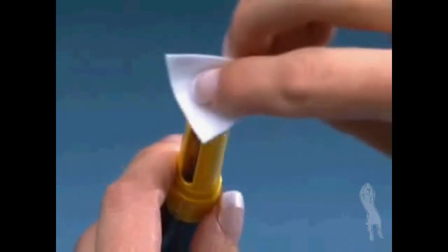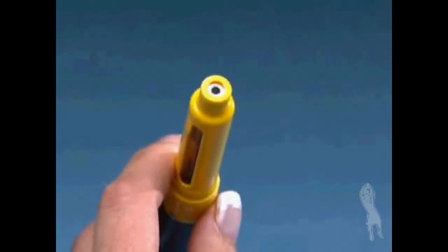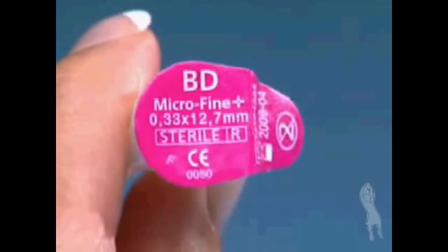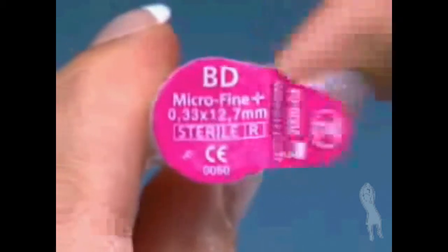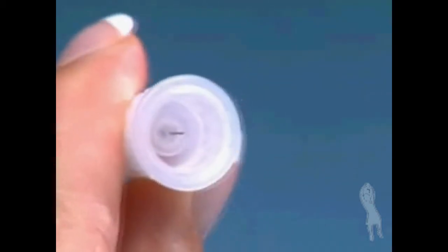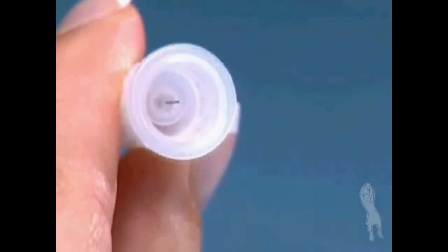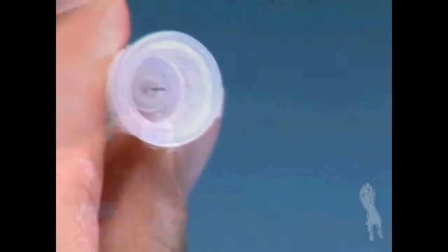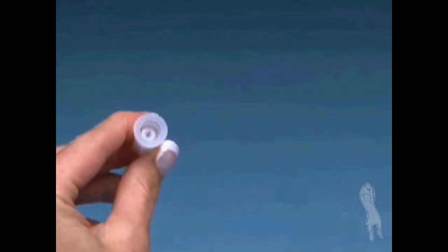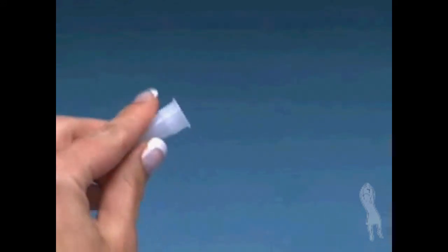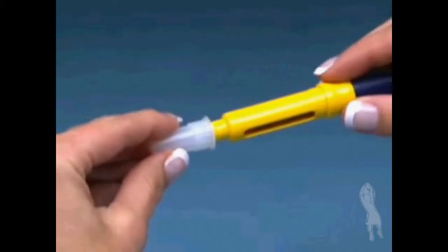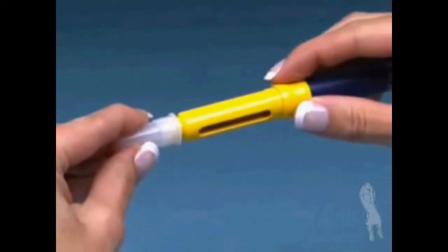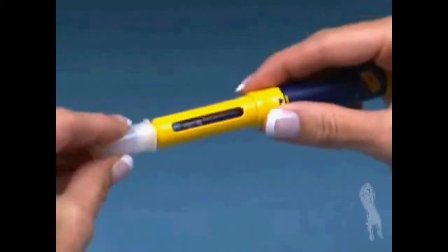Clean the open end of the cartridge holder with an alcohol wipe. Pick up the BD Microfine Pen Needle. Peel off the protective paper seal. Do not touch the needle or place an open needle on any surface. Hold the outer needle shield firmly in one hand and the cartridge holder in the other hand. Push the end of the cartridge holder into the outer needle shield. Screw them tightly together.